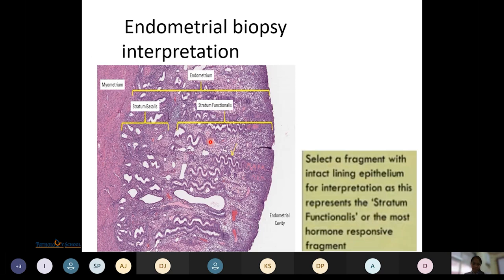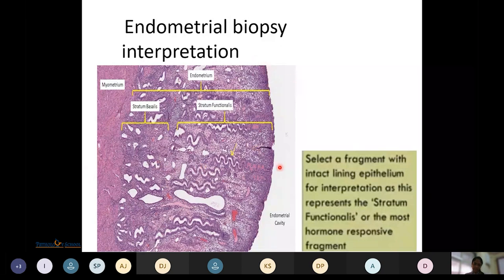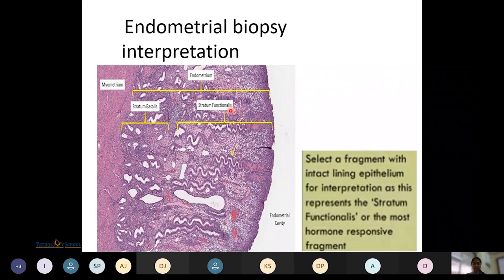On microscopy, the uterus shows the surface lining epithelium, below which lies the stratum functionalis, and below that lies the stratum basalis. Right below the basalis lies the myometrium. The stratum functionalis is the most hormone-responsive layer, so samples are taken from this layer.